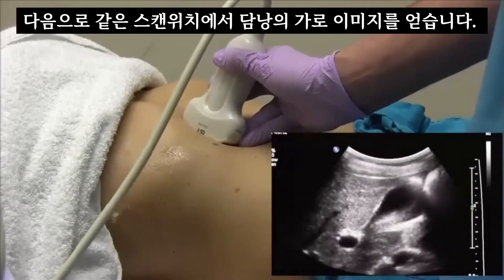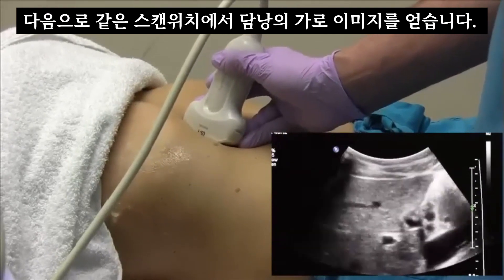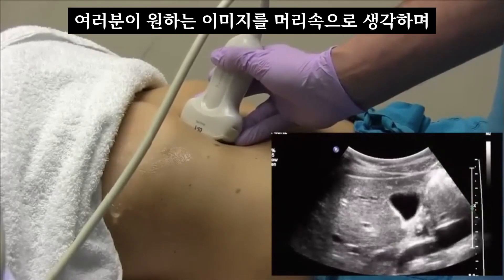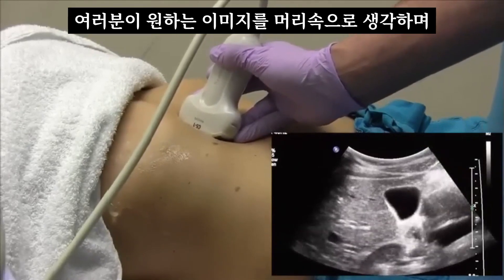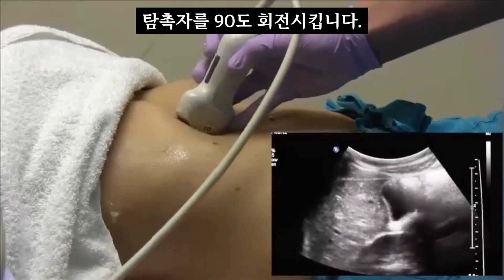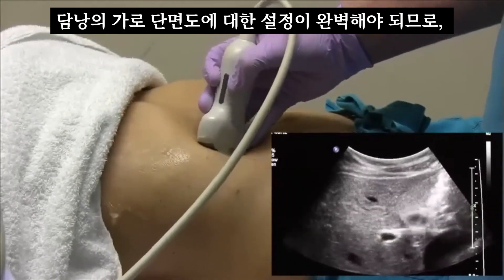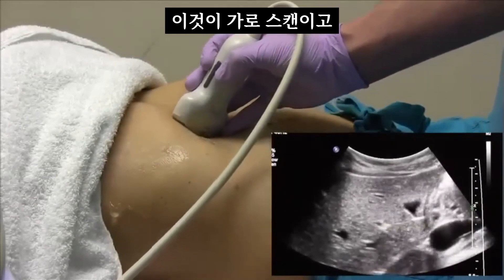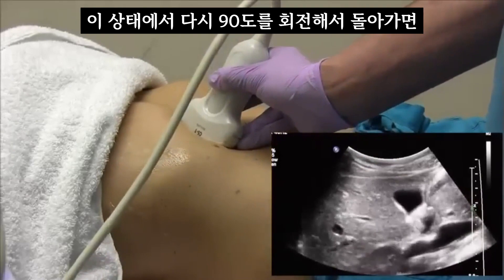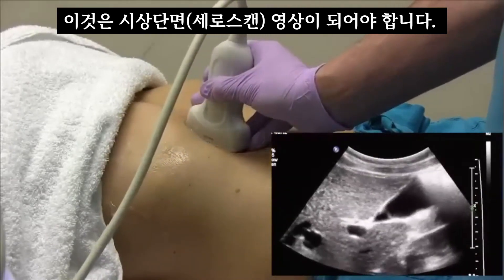Next we'll get a transverse image of the gallbladder in this same window. What you want to do is look at your probe and think about: if you turn your probe 90 degrees, you should be perfectly set up for a transverse gallbladder. This is our transverse plane, and if you go back 90 degrees the other way, this should be your sagittal plane.